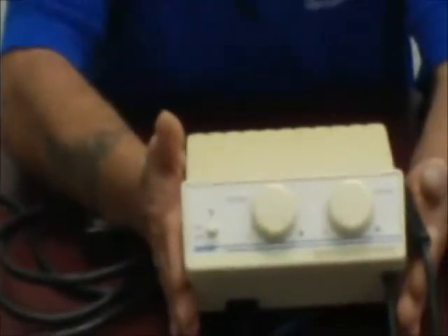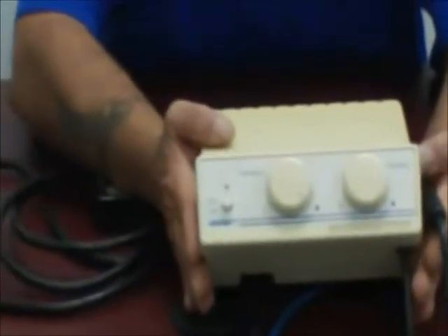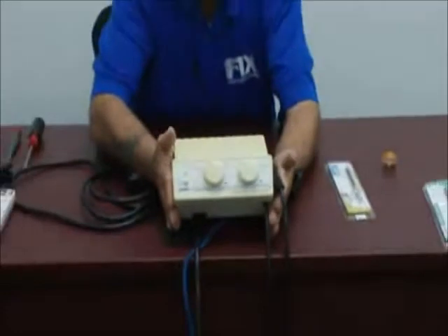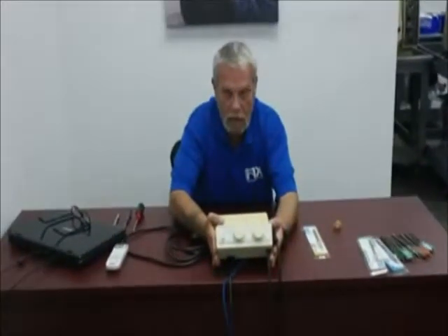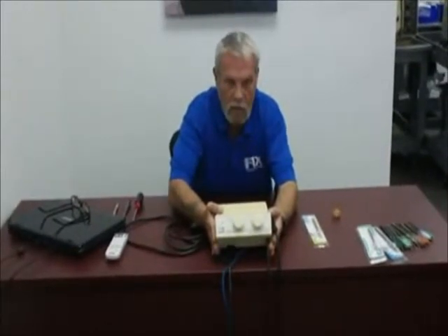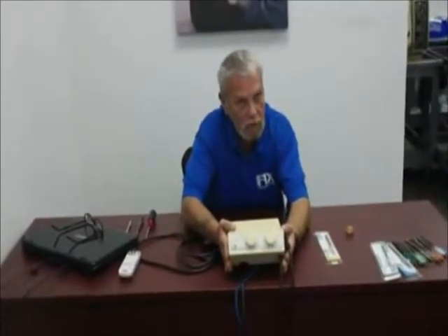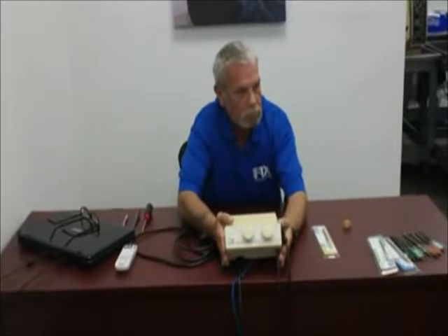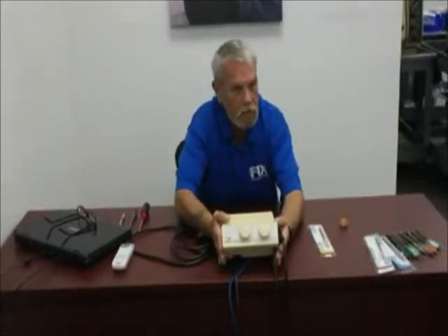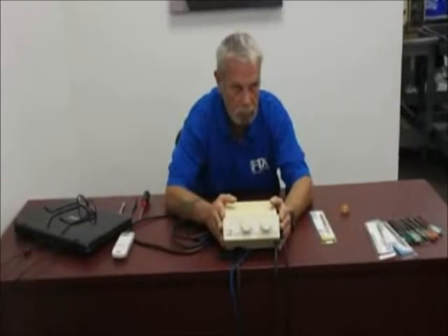You will hear the cavitron referred to under many different names: ultrasonic scaler, scaler, ultrasonic descaler, bobcat, clean machine — several different names apply to the same type of equipment. The cavitron name is a catch-all name for all ultrasonic scalers, but it is copyrighted by the Dent Supply Company. It's like Frigidaire and Kleenex are trademark names, but everybody calls every tissue a Kleenex and every refrigerator a Frigidaire. So don't assume when you get the dispatch that it's going to be a Cavitron brand.